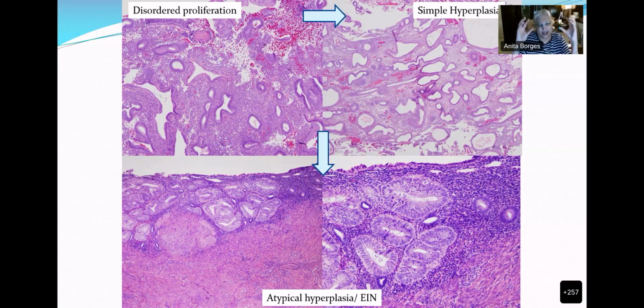Unopposed estrogen is a term that we should all learn how to use, okay? And I think quite often that when you say things like disordered proliferation and this and that, what you are seeing actually is the effect of unopposed estrogen activity. What it tells a gynecologist immediately, or whoever is reading that report, is that you have a system in which there is estrogen and there has been no progesterone for a very long time, and this patient may be cycling, may not be cycling, okay? But there has been no progesterone.